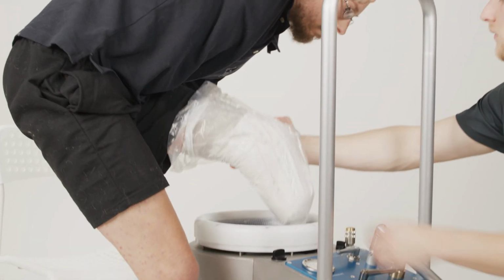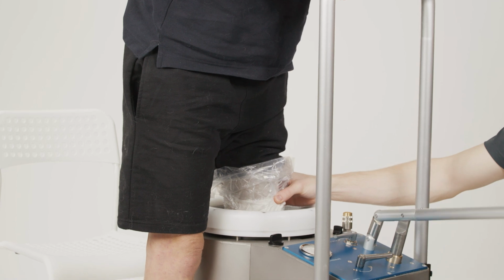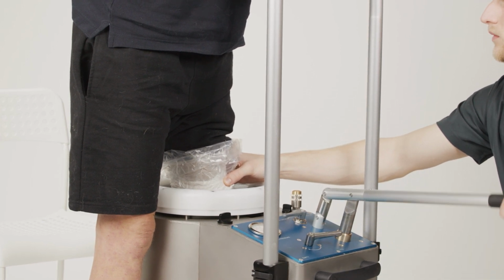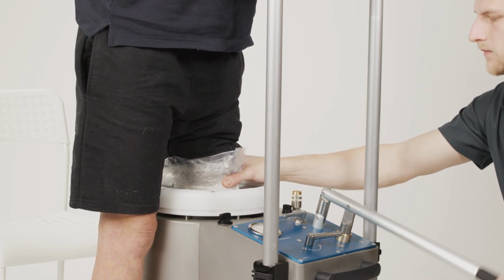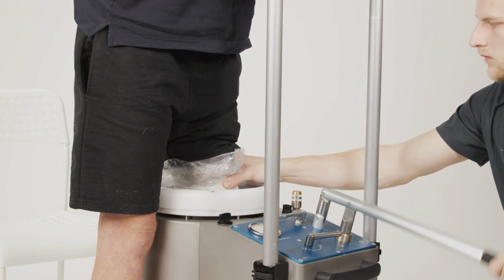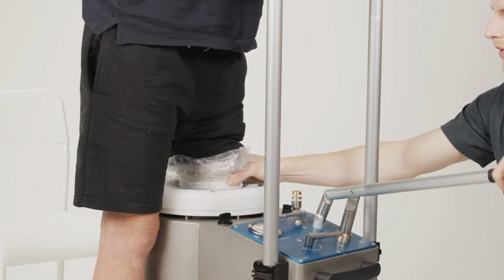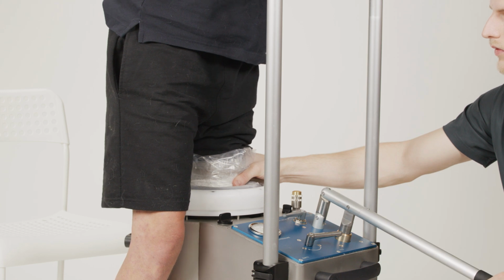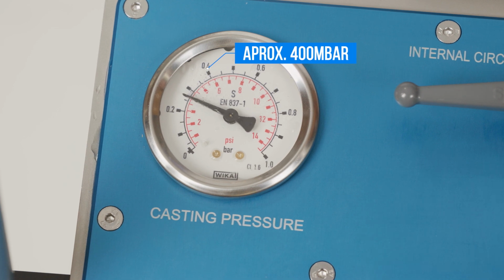Using the lever, activate the pump in order to pump the water from the outer tank to the inner tank. Levers on the gauge panel must be set to internal circuit and fill. In a standing position, the patient can now place his or her residual limb in the middle of the cylinder opening, so that there is light contact with the distal bearing cushion. The inner tank is now filled further, until the patient feels a slight pressure.